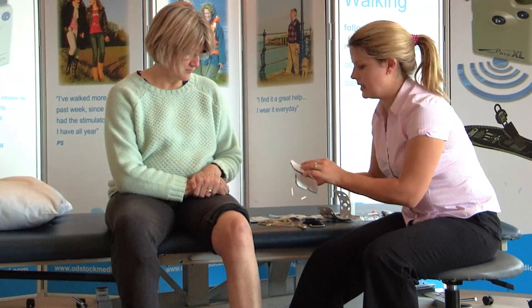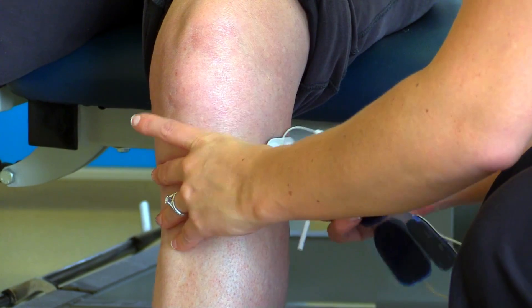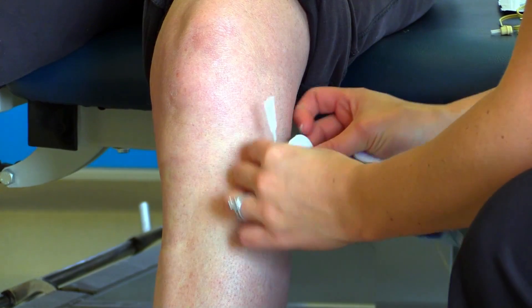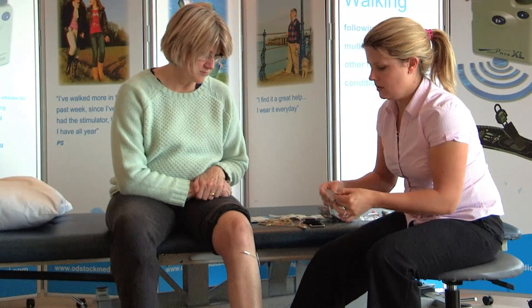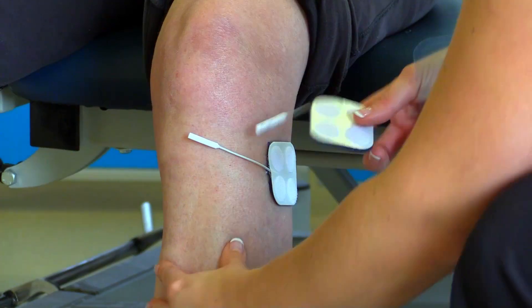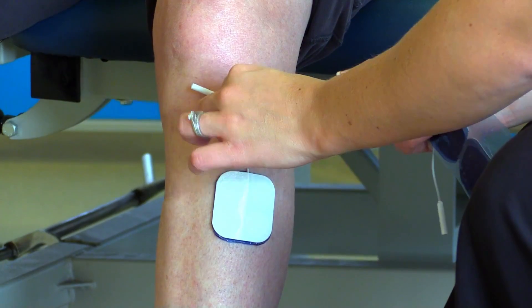The first thing you need to do is locate the position for the electrodes. A standard setup would be one electrode over the head of the fibula with the lead facing inwards, and one over the tibialis anterior with the lead pointing upwards.